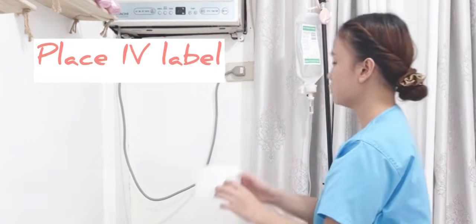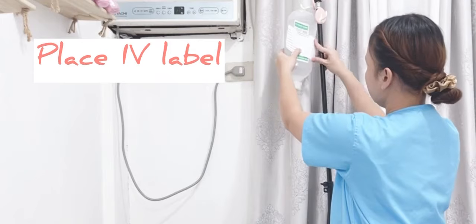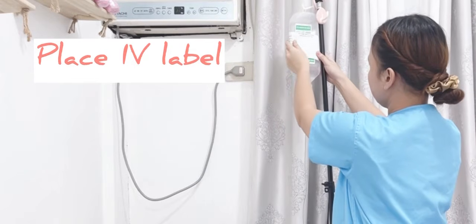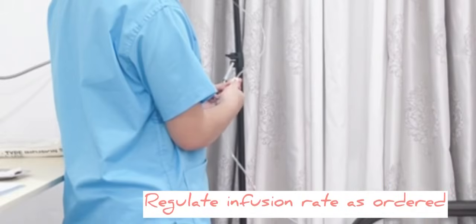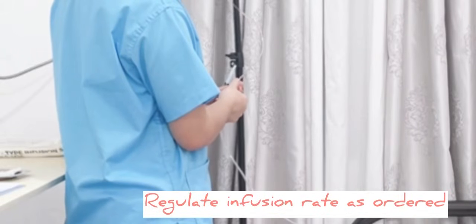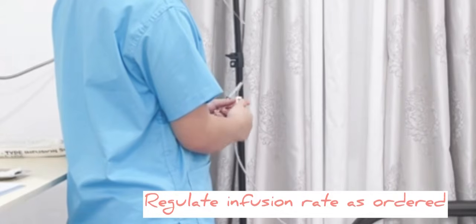Then place the IV label. The label can be easily read during infusion of solution. It informs nurses and physicians of contents of bag or bottle. Then regulate the infusion rate as ordered. It ensures medication is given over appropriate amount of time.